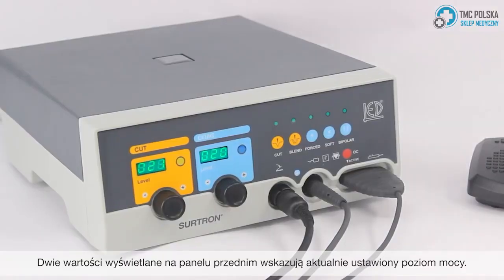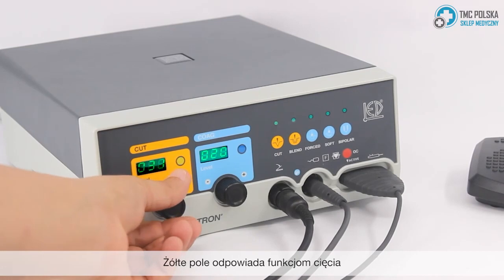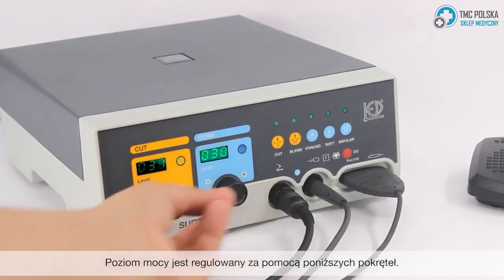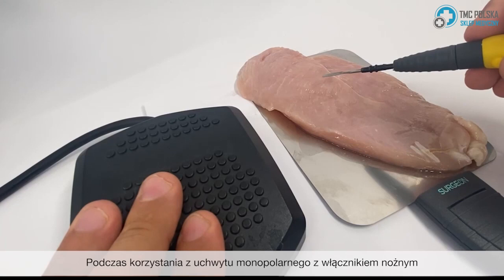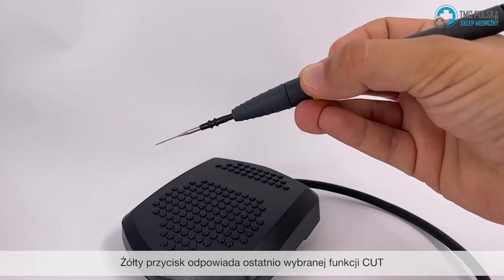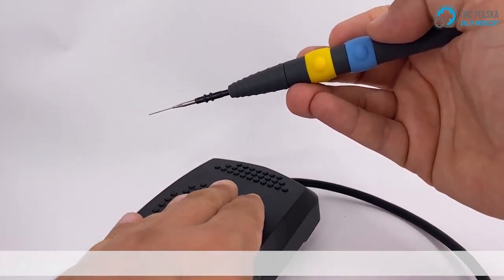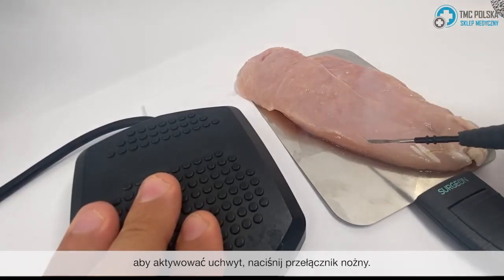The two value displays in the front of the panel indicate the power level currently set. The yellow box corresponds to the cut functions while the blue box indicates the coagulation functions. The power level is regulated by the knobs below. While using a monopolar handle with a foot switch, you will be able to switch between cut and coag functions by pressing the yellow and blue buttons. The yellow button corresponds with the last chosen cut function while the blue button selects the last chosen coag function. For example, you can pre-select the functions you want and choose the power level, then press the foot switch to activate the handle.